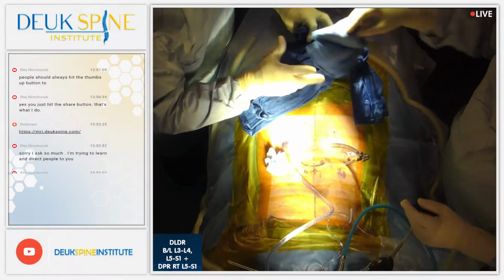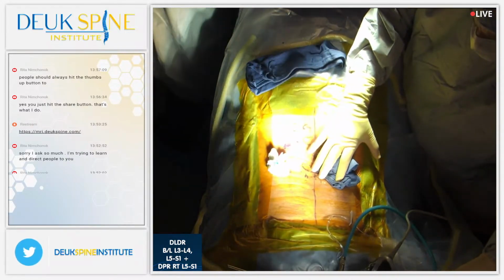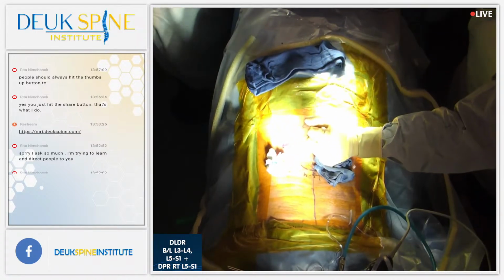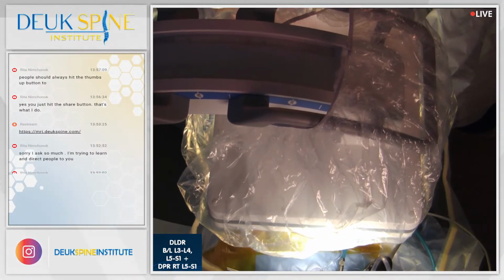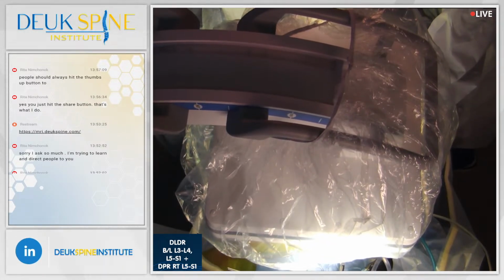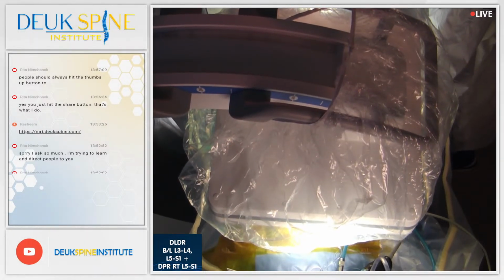Let's get this out here. We are going to have to make a separate incision for L5-S1 because the angle of the discs is completely off and they don't converge at the skin. So I have to make 2 incisions on the left. We're also going to have to do an incision for the rhizotomies. This patient is having facet joint pain as well, below his fusion.